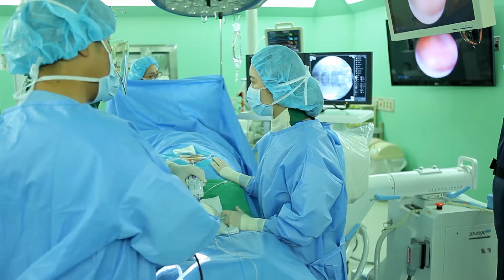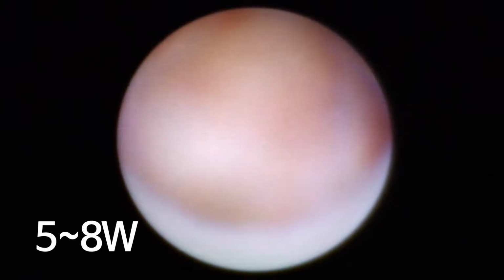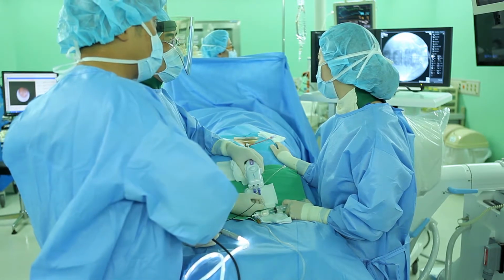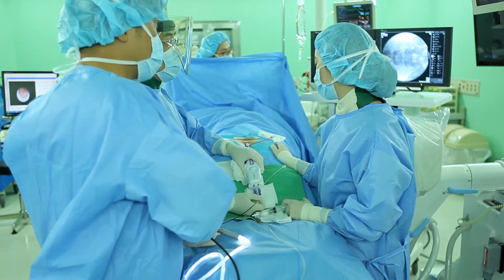Now, it's real laser treatment. After you are sure of the target point by stimulation, you may start lesioning at 5 watts and increase the laser power up to 8 watts for lesioning as long as the patient does not complain of either severe leg pain or muscle contraction during the laser firing. If the patient complains of severe leg pain, you should doubt wrong placement of the laser fiber and be required to adjust the laser fiber.